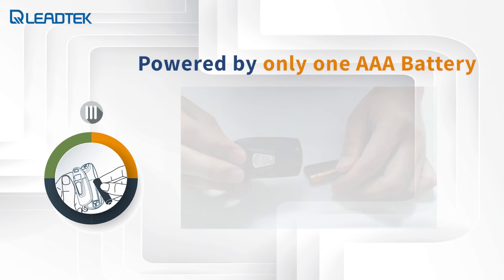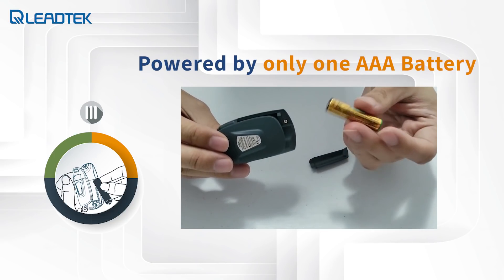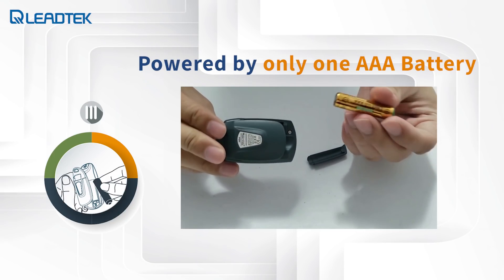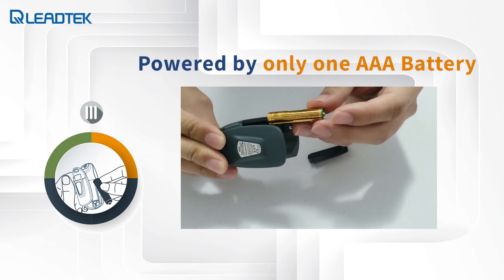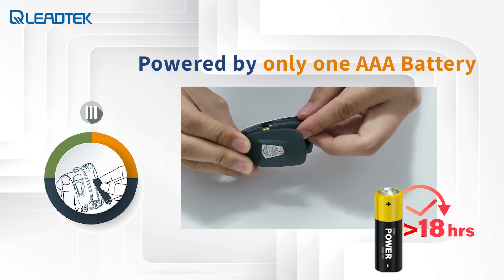The lightweight feature of the AT101 is achieved by having the device powered by only one AAA battery. One AAA battery can power the AT101 for more than 18 hours of operation, during which it can take more than 3,000 measurements.